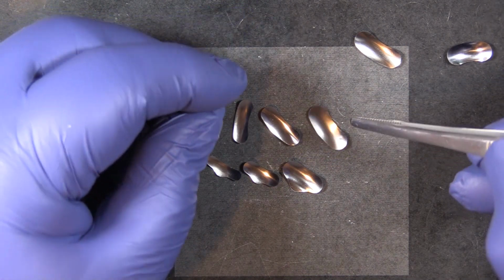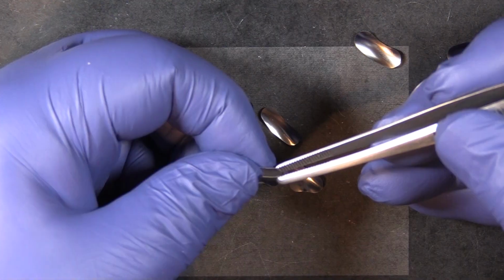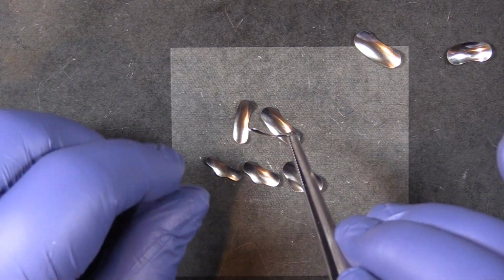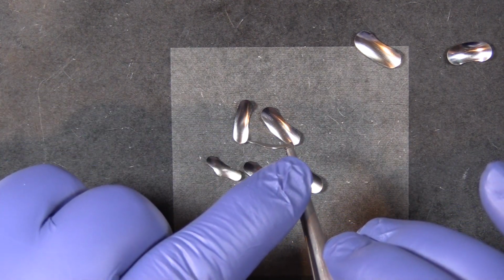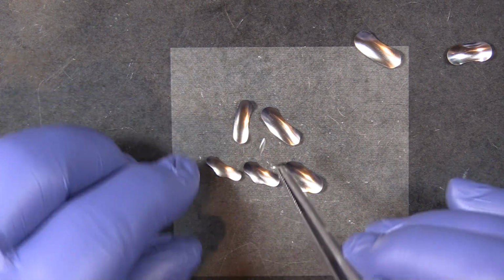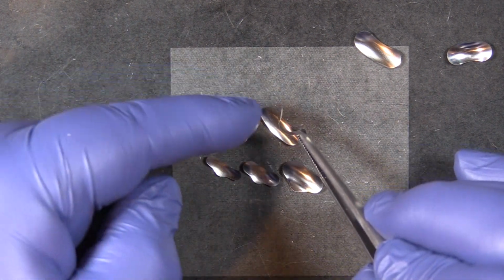When placing these, concave to the occlusal, smiley side up. That's the direction that they go in. And prior to placement, you can just take a corner of the band, bend it over a little bit so you've got a nice angle. That's going to be well outside of the area that you're restoring, so you don't have to worry about any issues there. And give it an extra little curl, and then you can slide it in.